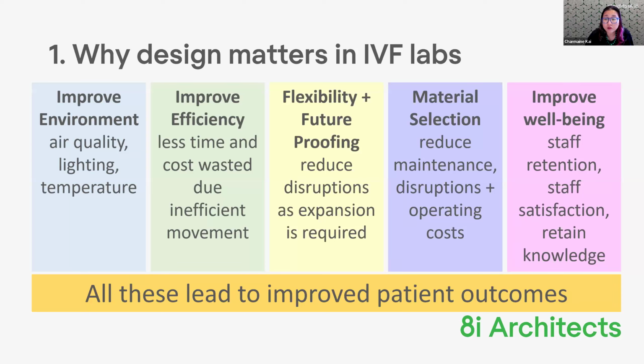The other thing that's really important for material selection is VOCs, and I'll talk about that in more detail a bit later. It's well documented the harmful effects of VOCs on embryos and gametes. It's something that has been on the radar for a long time, and I'll give you some pointers on materials that, even though they say they are low VOC, because there's a lot of low VOC building products on the market now. In fact, if you actually test them, which is what I generally do when I design labs, you will find that they are not to the levels that's required in an IVF lab.